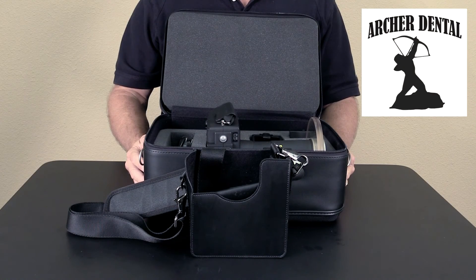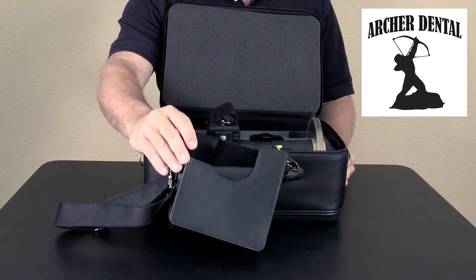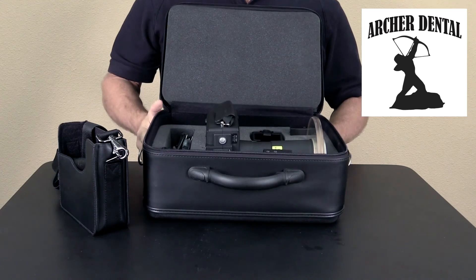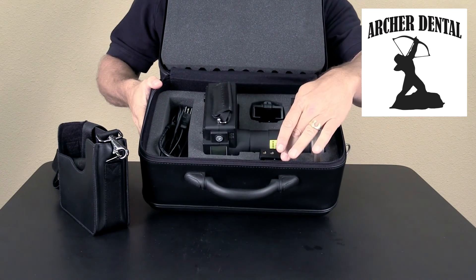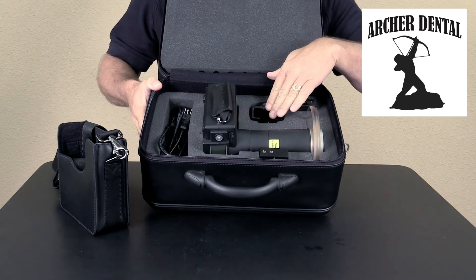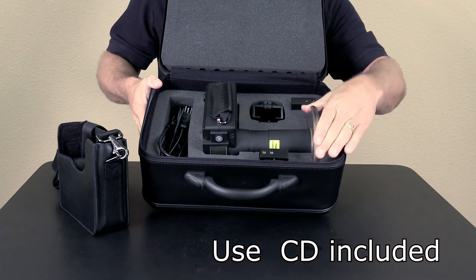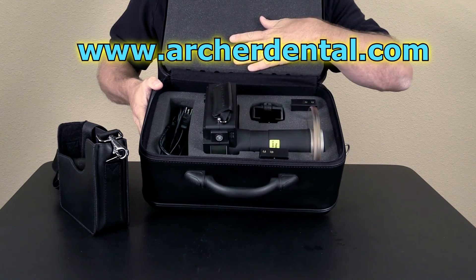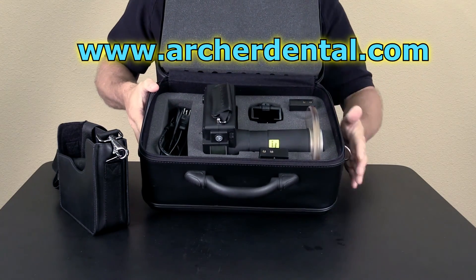The Vector MaxRay comes packaged with a neck strap, two batteries, a battery charger, a cable for the battery charger, a lead-infused shield, the unit itself, and a UCD — along with a handy carrying case.